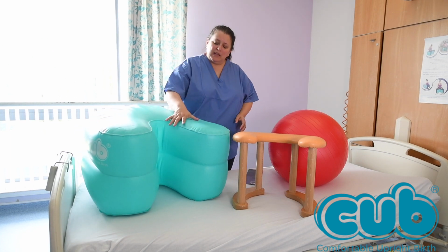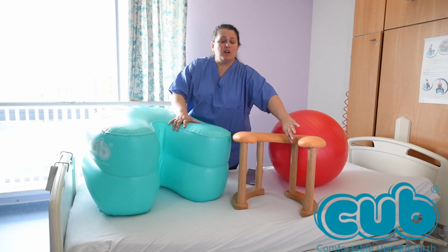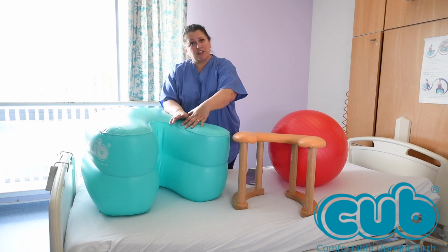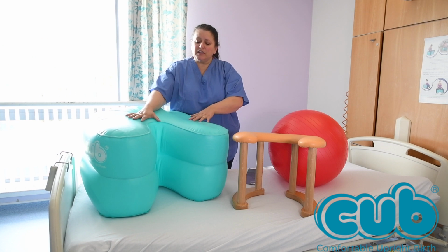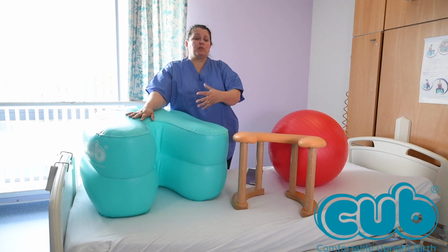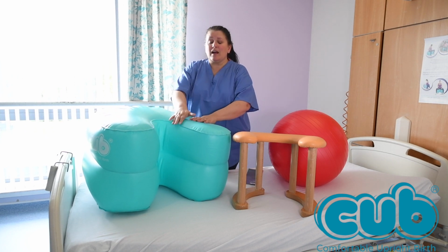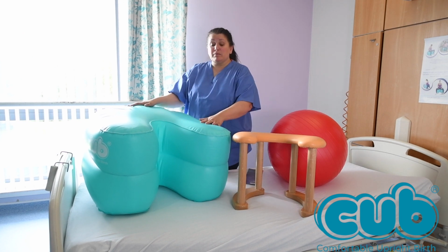Because the CUB is made of an inflatable material, it doesn't actually cause any pressure on the inside of the thighs, so it's not got the same potential to inhibit venous return. So if you happen to be using it at single inflation, it's fine to use it for a longer period of time than you would need to. Again, it's about your judgment as a professional about what's happening in that situation at that moment in time. But the CUB doesn't have these harder edges, so the potential for inhibiting any return is minimalised.